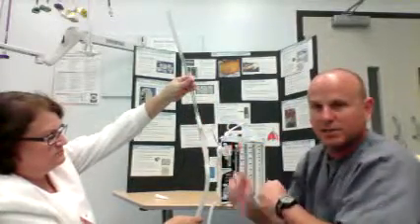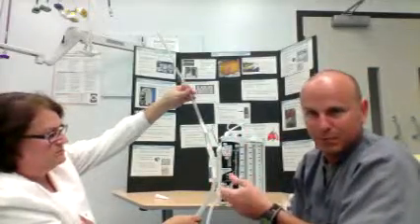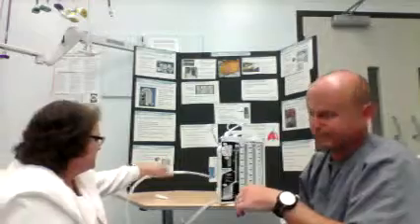So please, please, please pay attention to the way you tape chest tubes. The other way, I've had real-world experience where it's come out, the patient with a hemothorax, it's a mess. Again, you just introduce atmospheric pressure into the patient, and whatever progress you've gained on expanding that lung, you could have just lost it. Could have sent the patient into respiratory distress or death. Yeah, exactly.